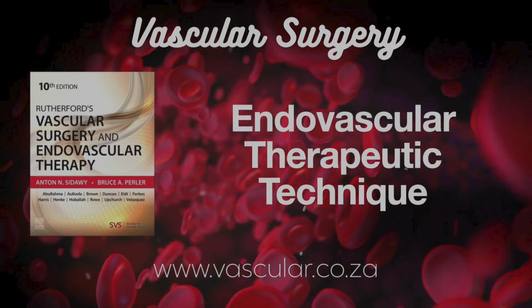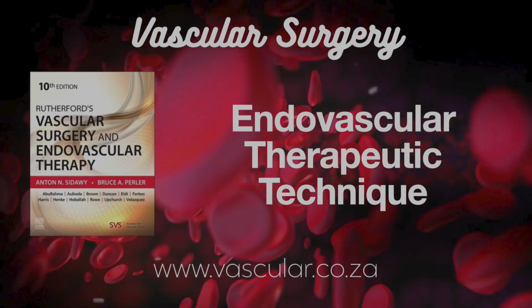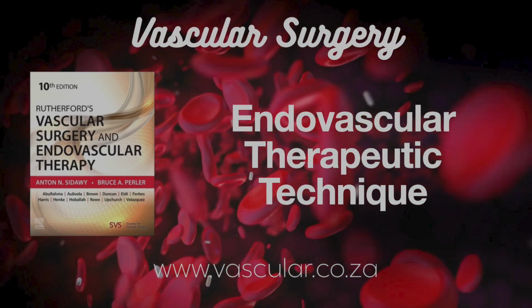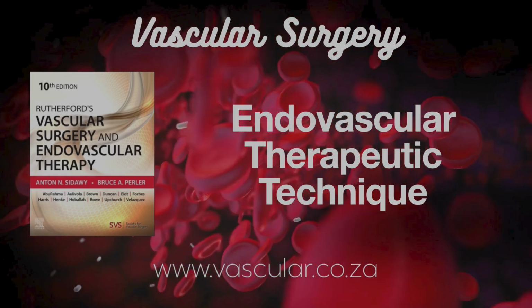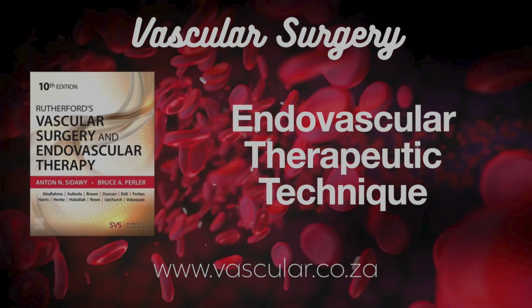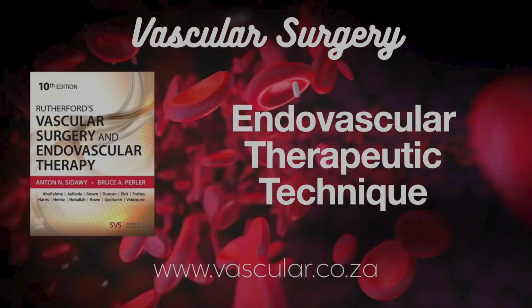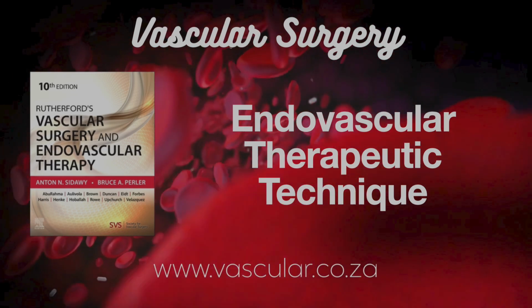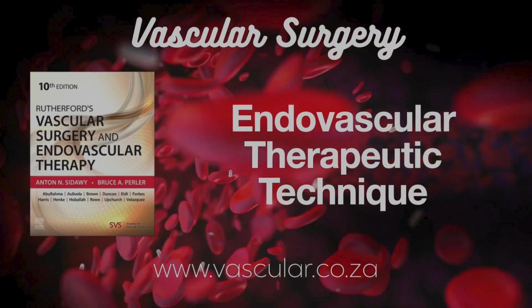Now, drug-eluting stents, DES, for peripheral arteries. We talked about drug-coated balloons, no stent left behind. How do peripheral DES compare? DES were developed to tackle the big limitations of bare metal stents, in-stent restenosis and stent thrombosis, especially in long lesions or multiple stents. The idea is the stent itself slowly releases an anti-proliferative drug into the vessel wall. Like the coronary DES. Exactly. Paclitaxel, sirolimus, those drugs significantly cut down restenosis in coronary arteries. But translating that success to peripheral arteries has been more challenging.